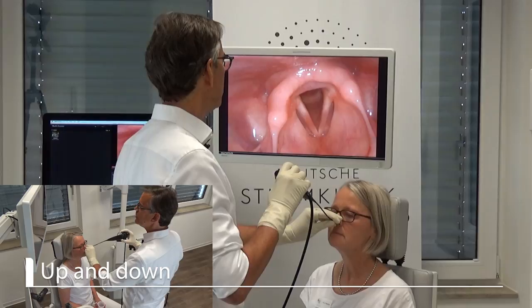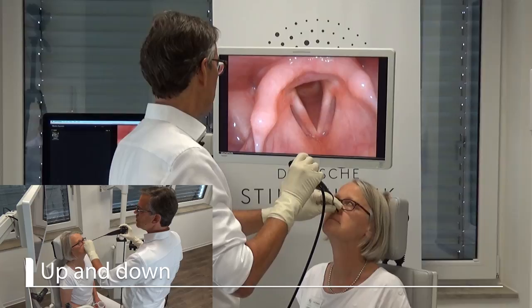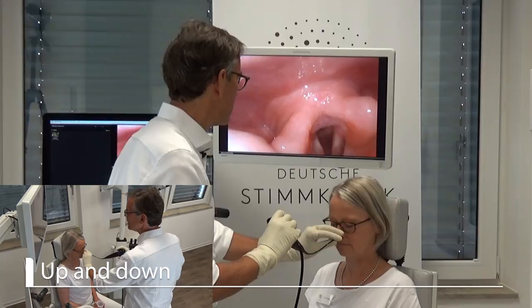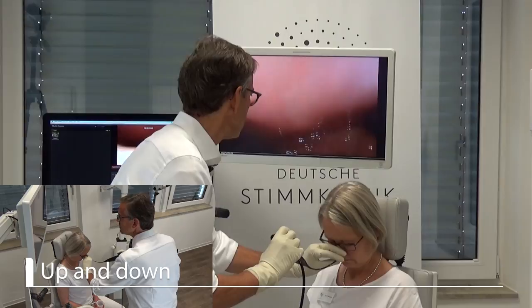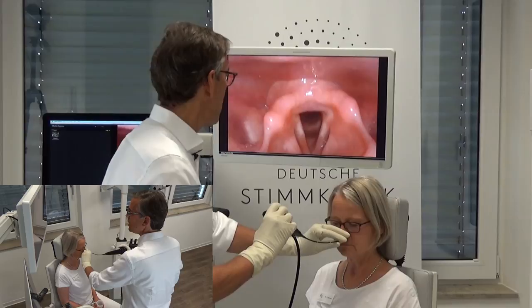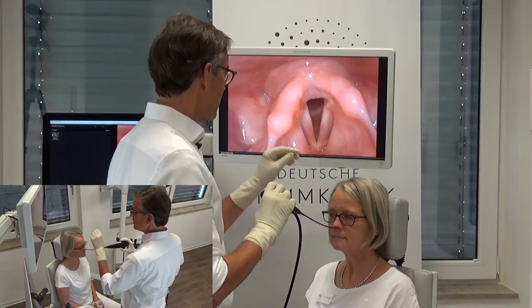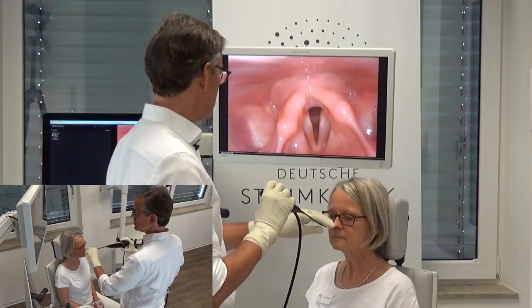I can also go up and down — go up please — to see what is happening at the laryngeal side of the epiglottis. But I cannot easily see the trachea. Whereas if I ask her to chin tuck all the way down with the head down and give me a long inspiration, I can have a nice look into the trachea but not the epiglottis. So the head position has to be coordinated with my dipping maneuver. It is important that this is done during inspiration and finalized with retraction of the endoscope during the inspiratory mode.